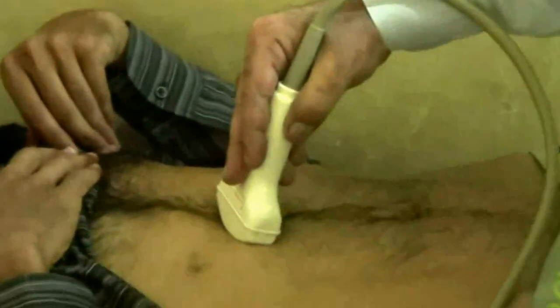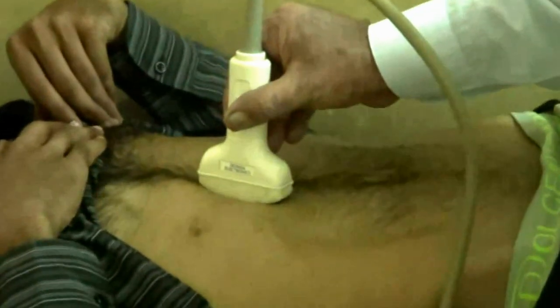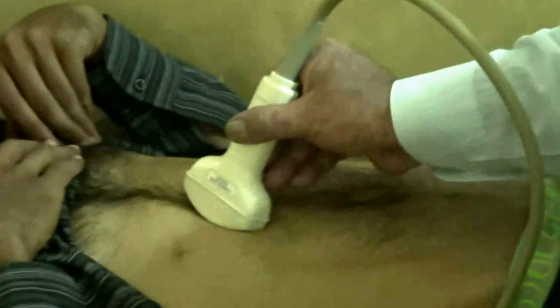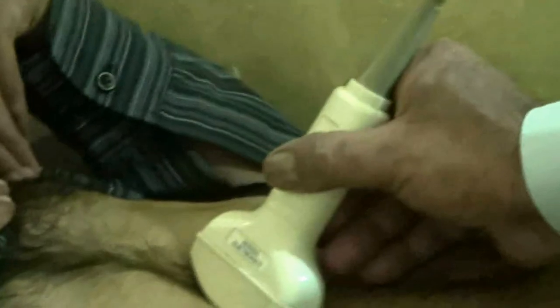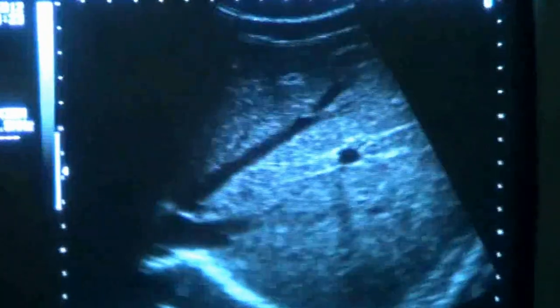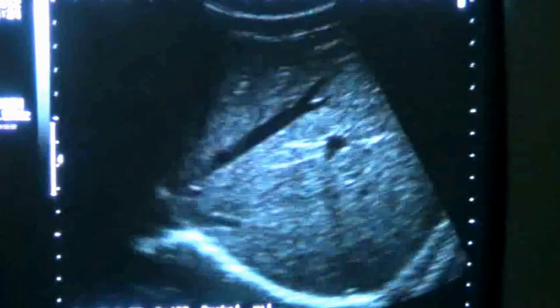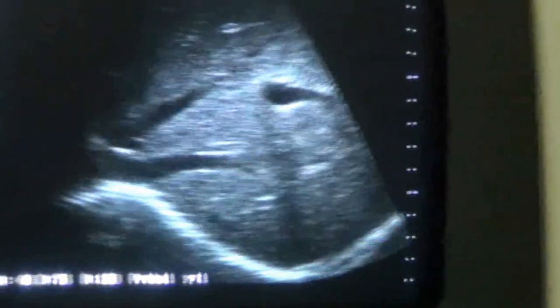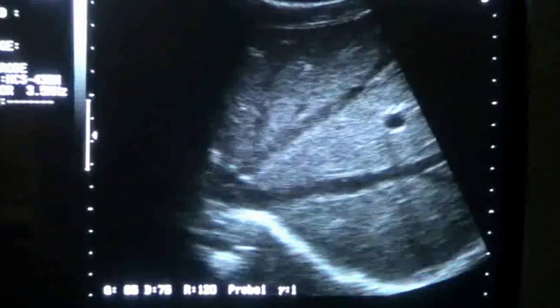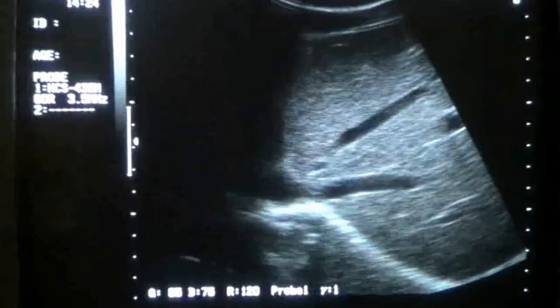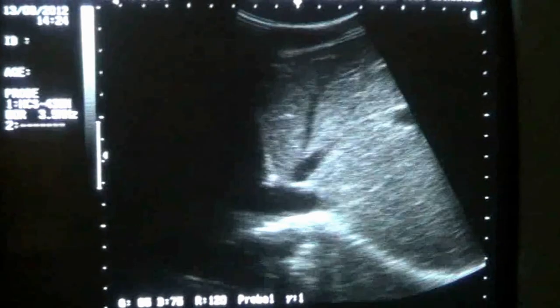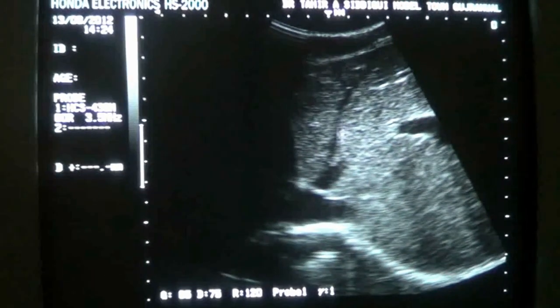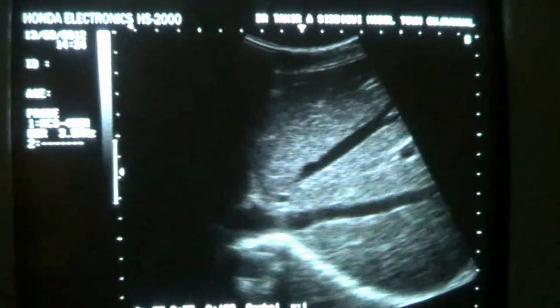In the first technique we were scanning with the marker towards the patient's right side. Now give a 180 degree rotation to the probe — the marker moves to the opposite side. Keep it there and you will see the vessels: this is the right hepatic vein, here you are seeing the middle hepatic vein, and here the left hepatic vein as well. Left, middle, and right.